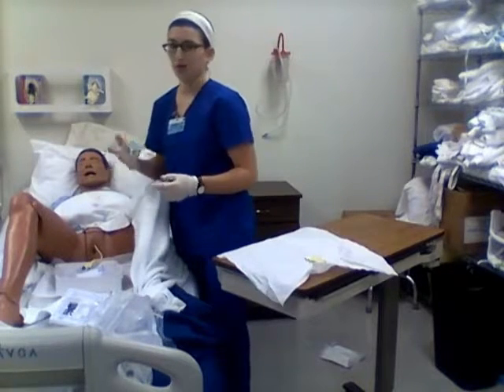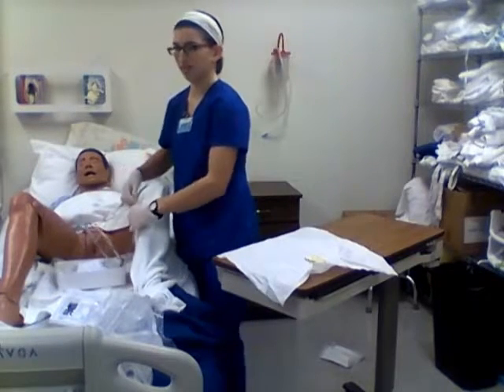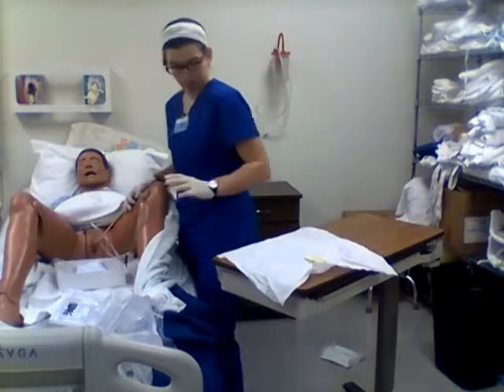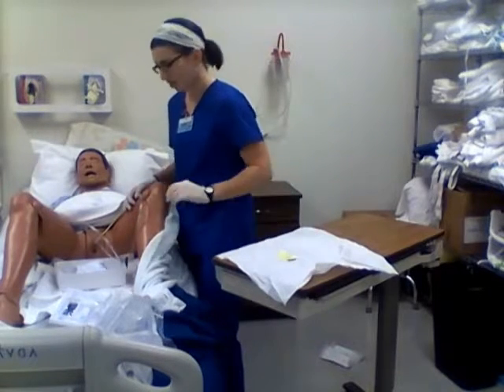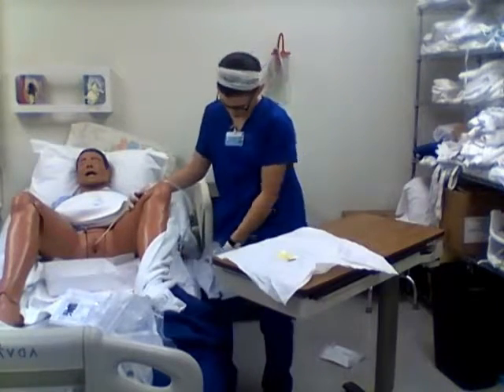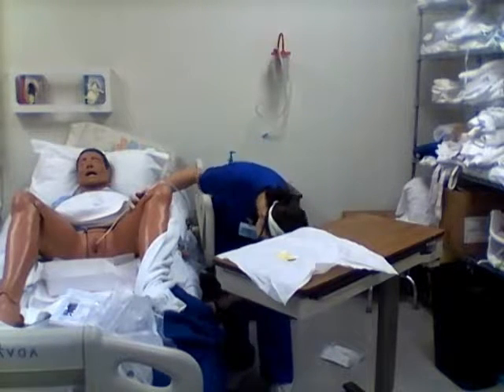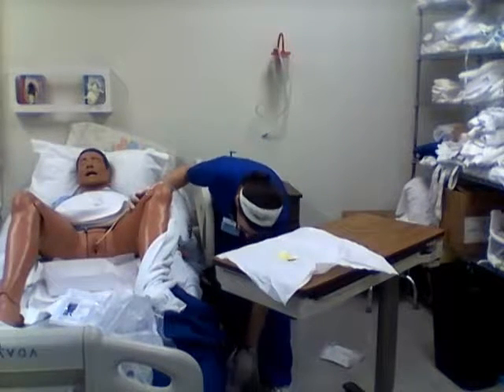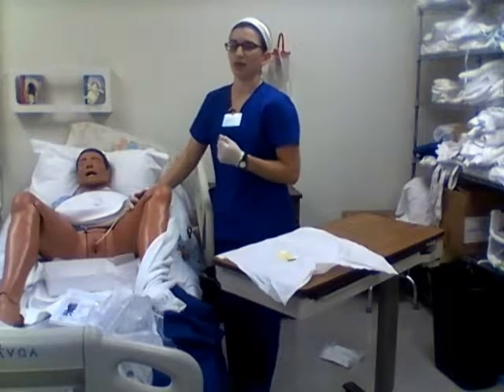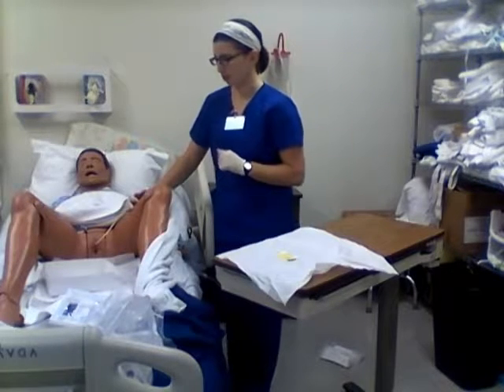She is comfortable, and I do not have a leg strap provided for me, so I'm going to verbalize it. So if I had a leg strap, I would strap this to her leg. I would label it with my labels, and I can go ahead, I can hook this to the side of the bed frame down here, and I'm going to observe the urine for any color. I'm going to look for any kind of abnormalities that could be associated with it.